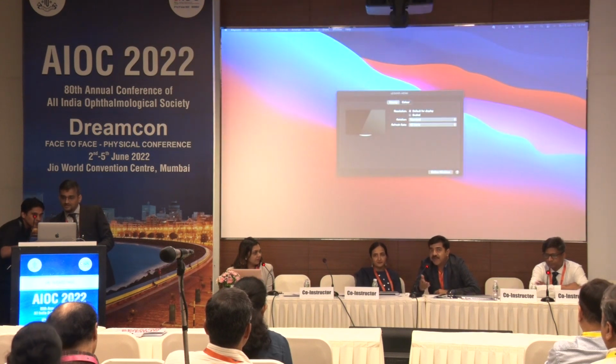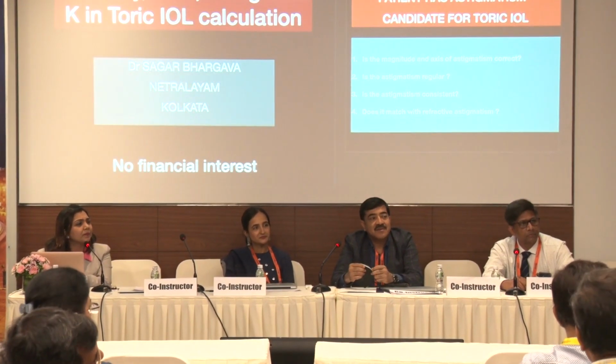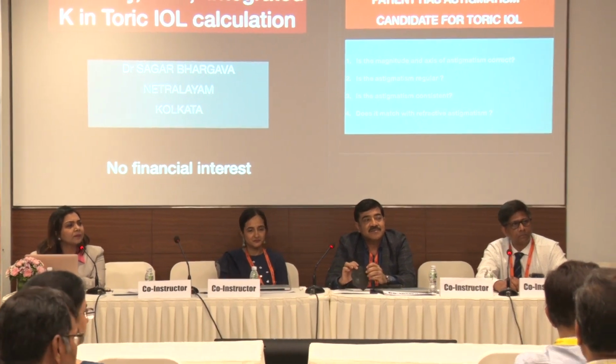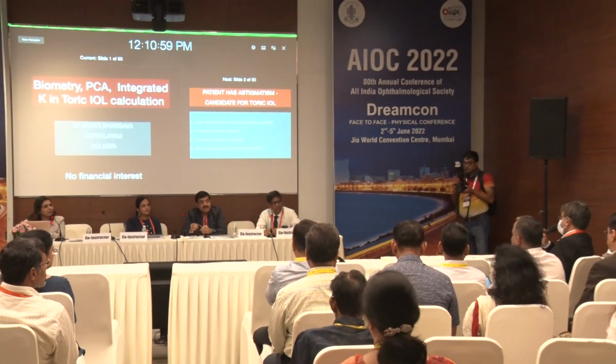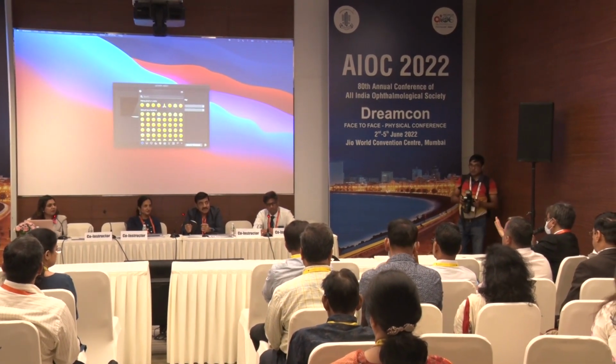And with the availability, even with the Femto, my cutoff remains the same. It's a bit more, 1 diopter, maybe 0.75 for trifocals, and for normal lenses it is 1 diopter, if I am doing a Femto LRI in them. With-the-rule astigmatism you can still let go. But in my case, generally, my cutoff is 1. If the patient has no cylinder in the other eye, then my cutoff is less, maybe 0.75, maybe 0.5.